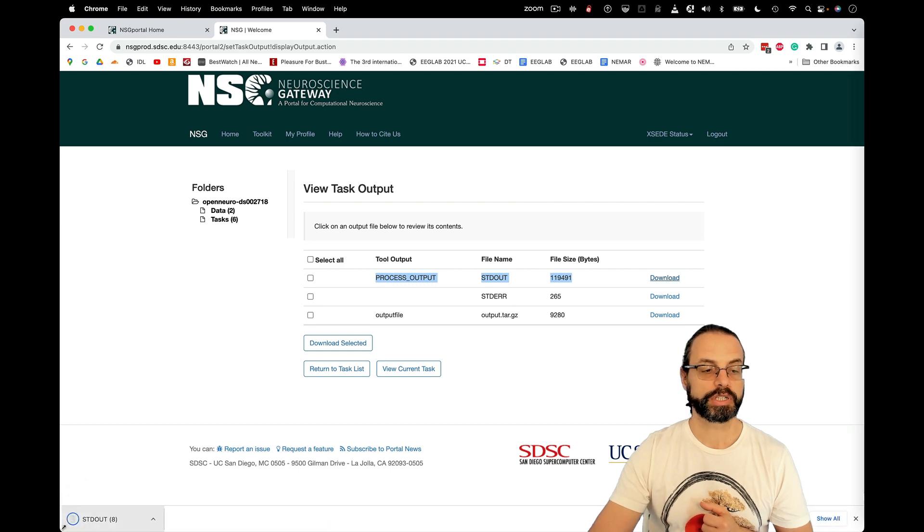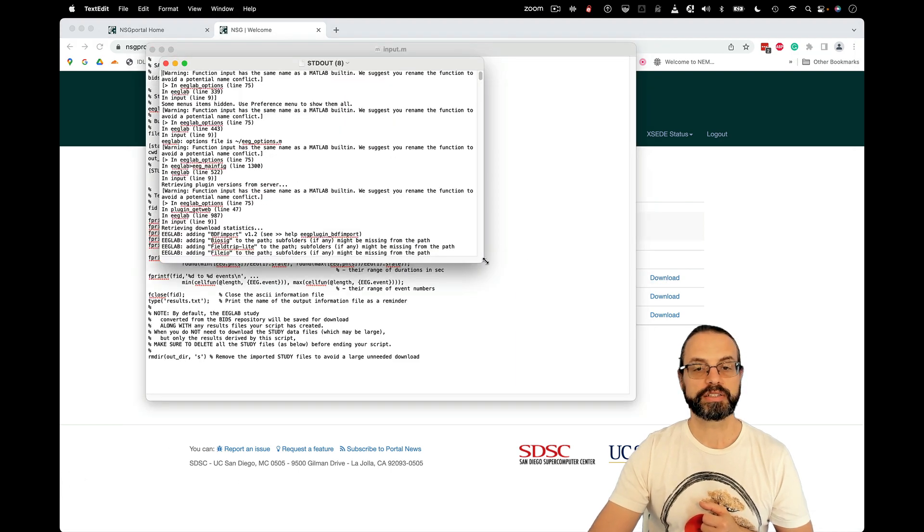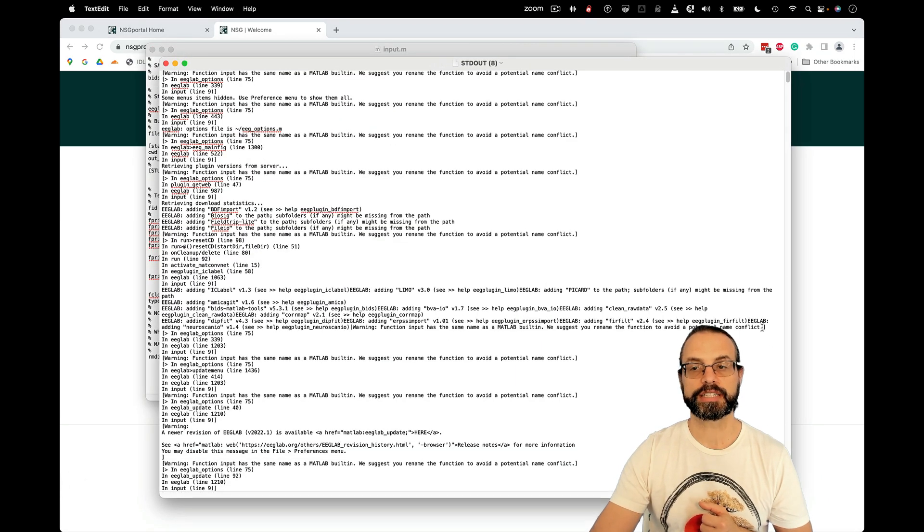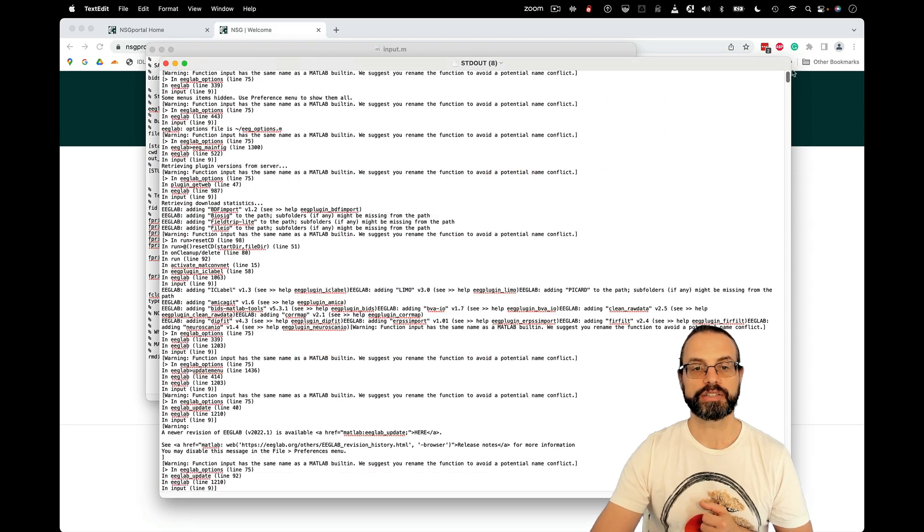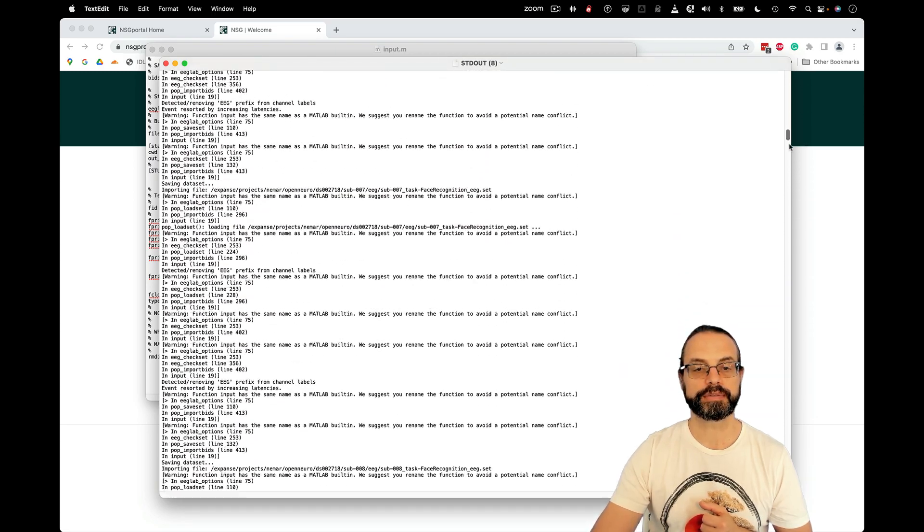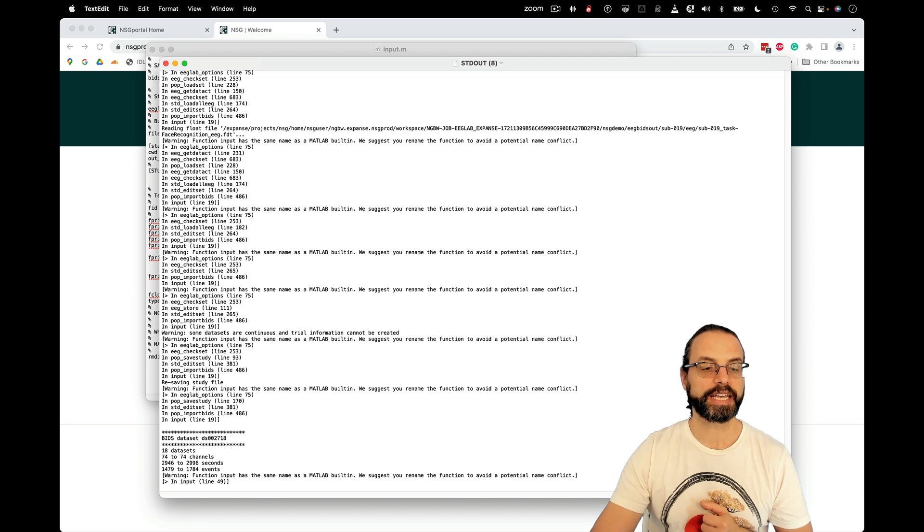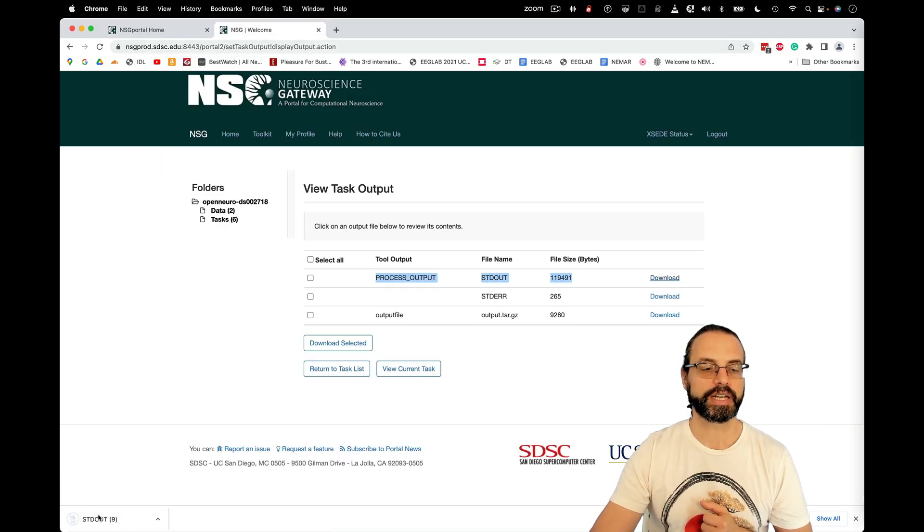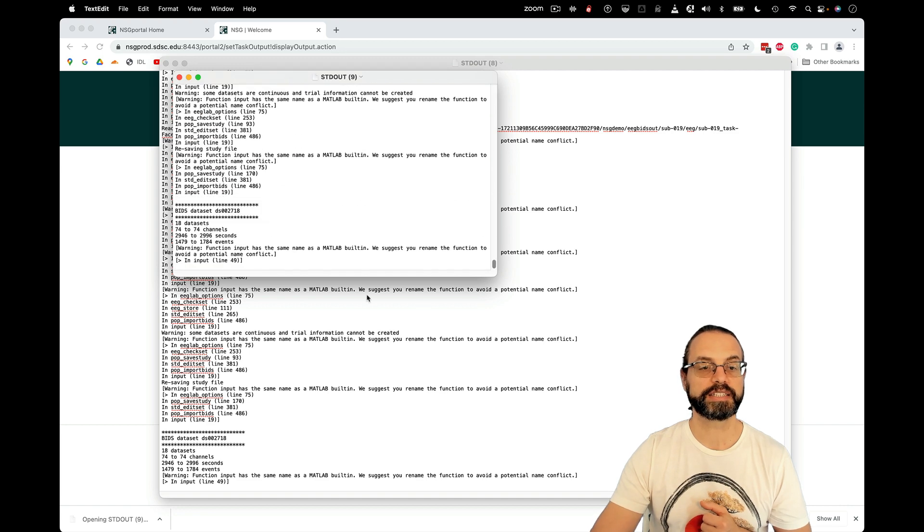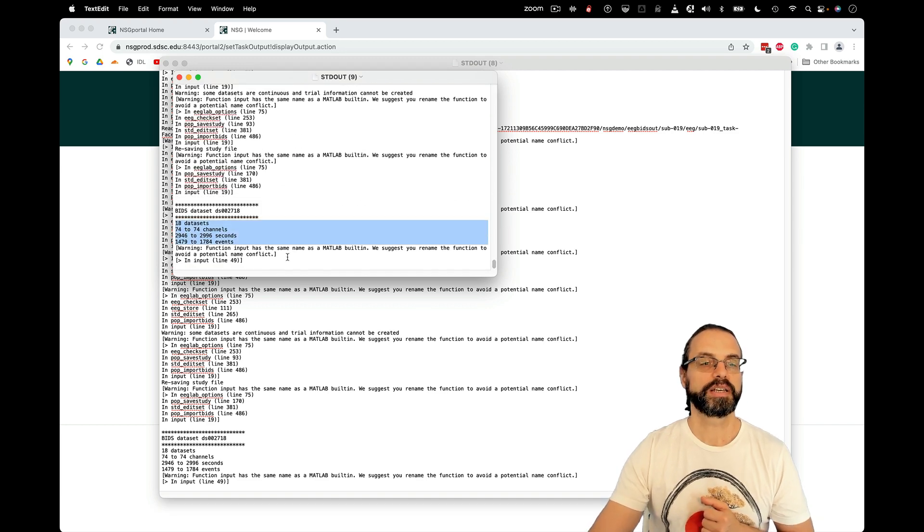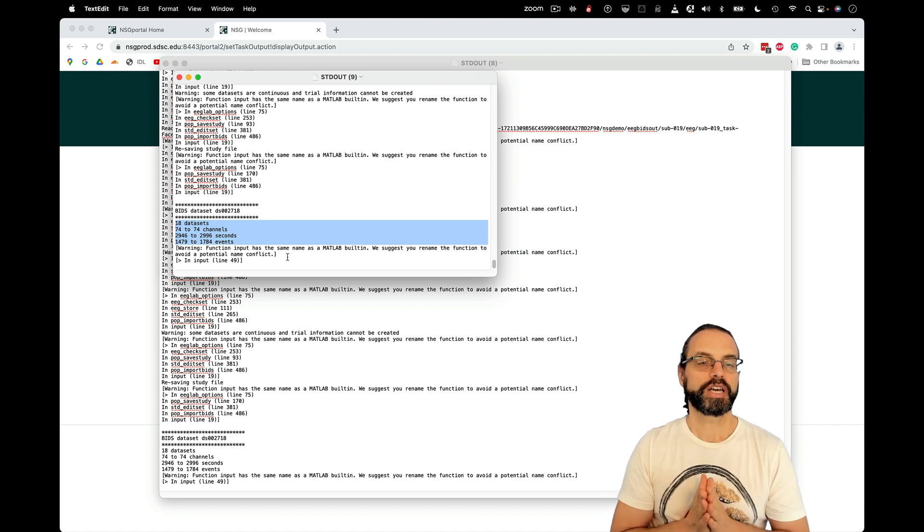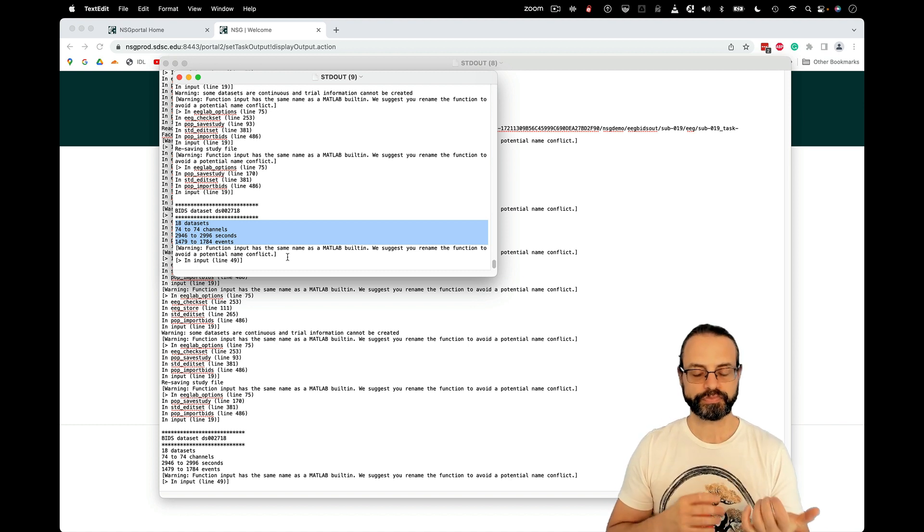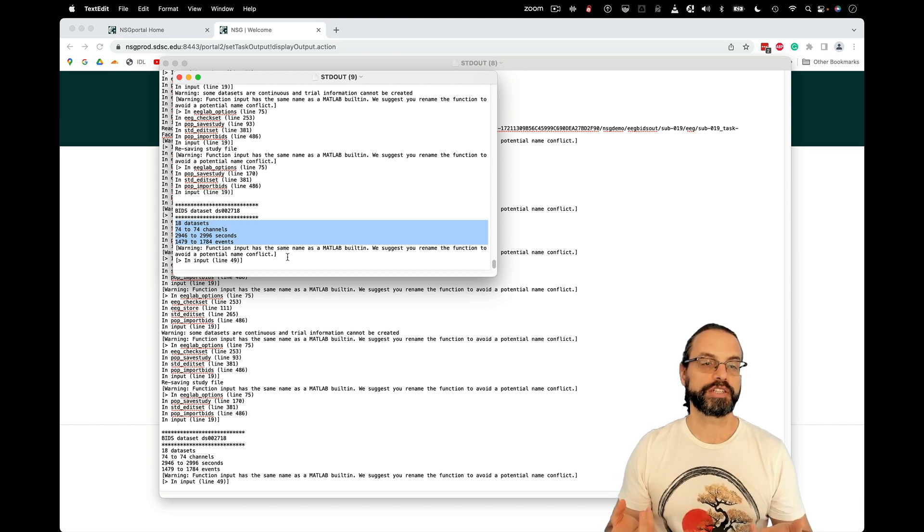Some text output, which here contains the text as if you had run it on your own machine. So this is the EEGLAB output. And then at the end, it contains some statistics that were computed on these datasets. You see 18 datasets, 74 channels, how many seconds, etc.